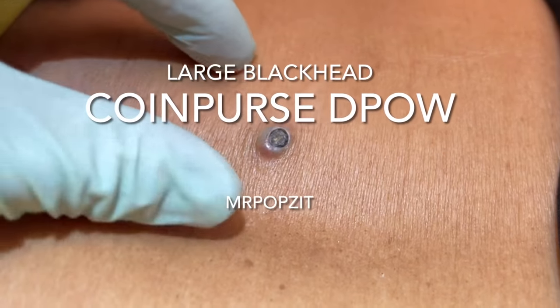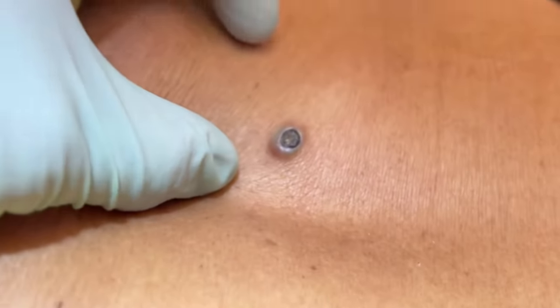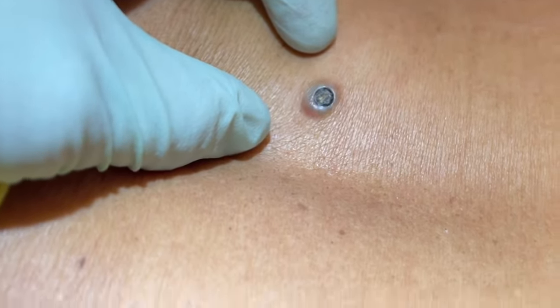Hey guys, Greg Lindstrom, PA here. We can see here we have quite a large dilated pore of Winer — they're called — a little cyst there right at the surface.